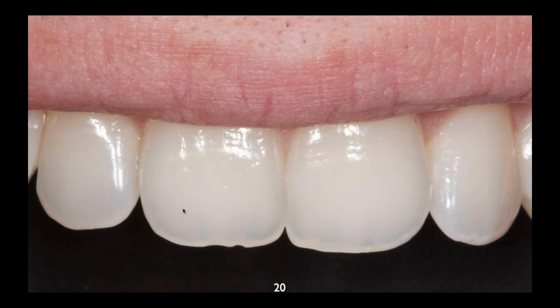So basically, can you guys see my arrow? Right in here, this halo is the same as the dentine up here. So when you're building this crown up, you can put in these lobes, then you can put a translucent bluish. If you haven't done a lot of these, in the first bake, don't worry about it. Do it on the second bake. Just cut a few lobes in there, and then put the blue, and then build up with the enamel, and then the halo. You just put the same dentine that you did up here. And that's how you reproduce that effect. It's easy to do, and it's very natural.